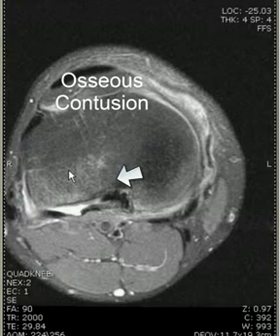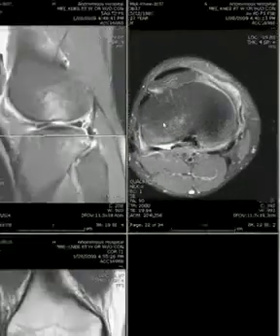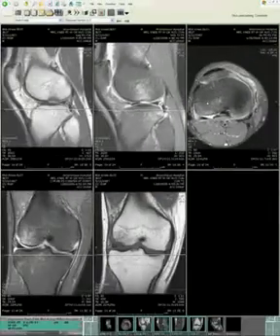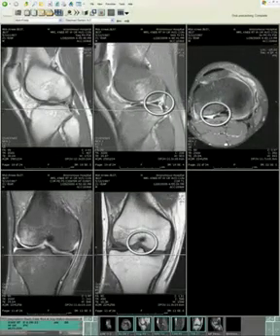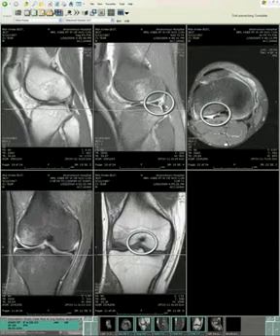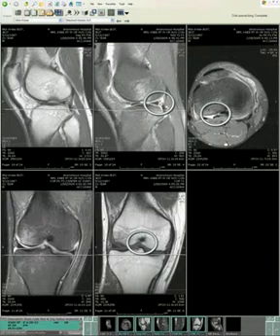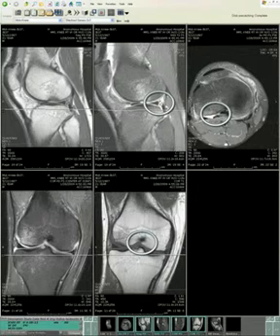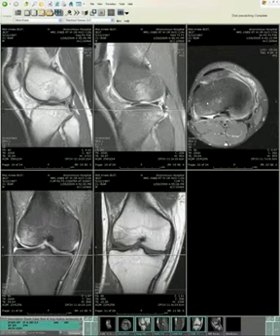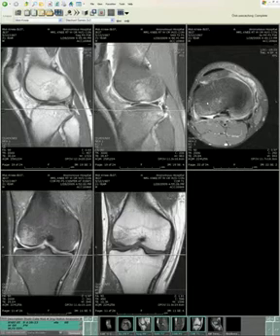In summary, this represents a patient with a full thickness anterior cruciate ligament tear at the proximal extent, with associated vertically oriented tears in the posterior horn and body of both the medial and lateral meniscus, and the typical contusion pattern in the posterior lateral tibia and femur.